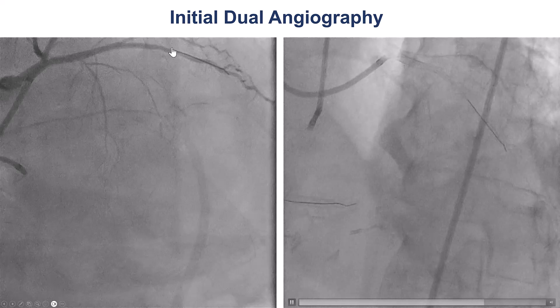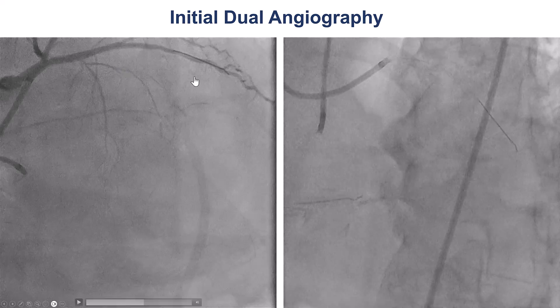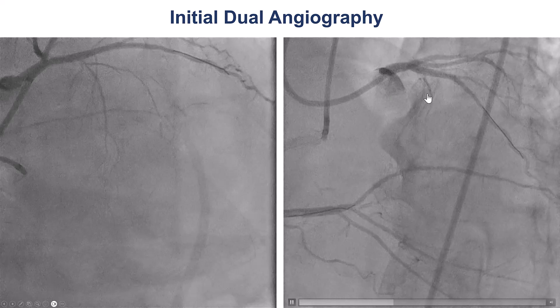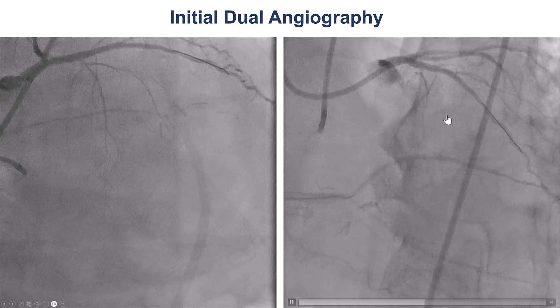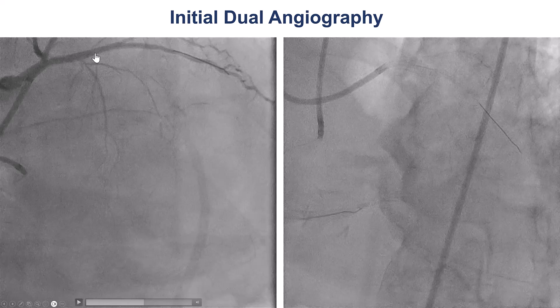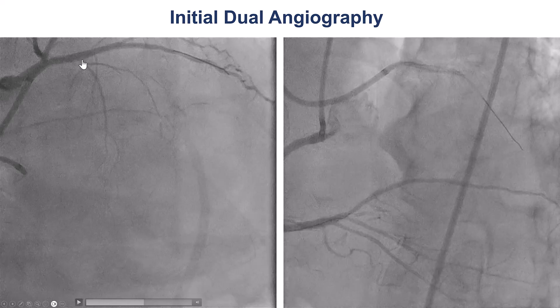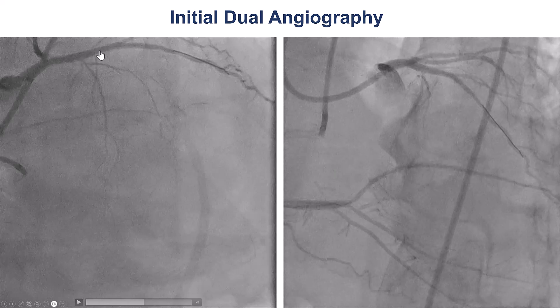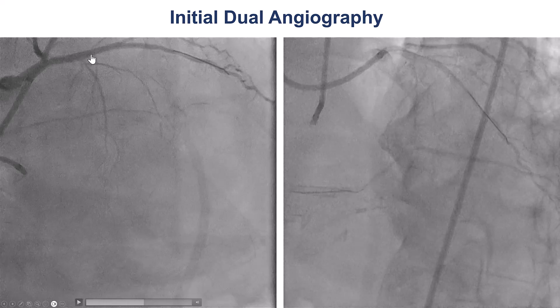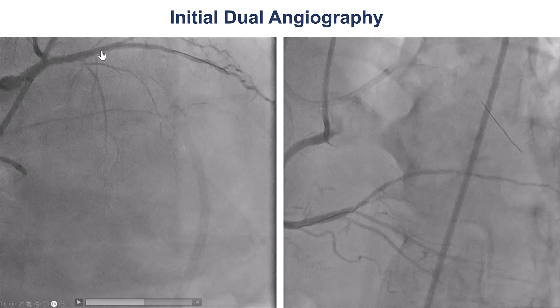We can see it here as well. There is not really quite a line-up of this branch with the LAD that is filling retrogradely. Essentially, the LAD is probably occluded somewhere in this segment. It is unclear where the proximal cap is, and there is also a stent there.